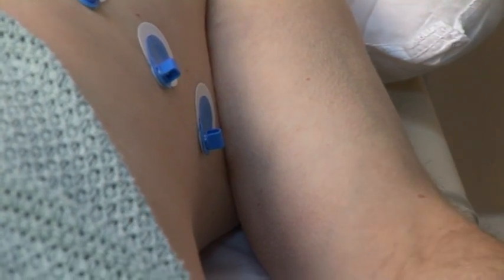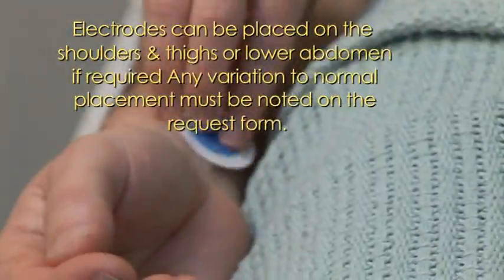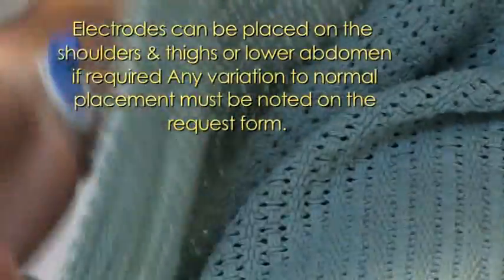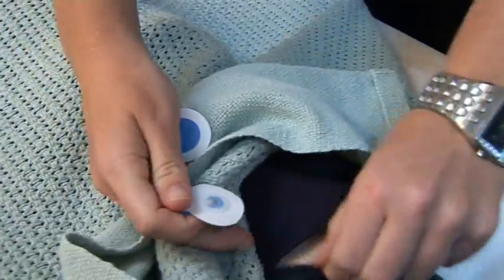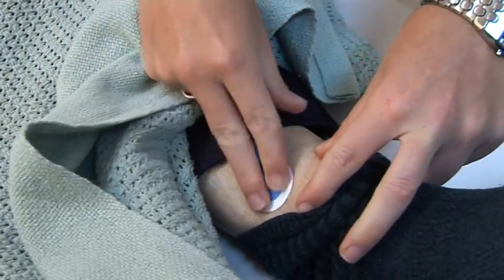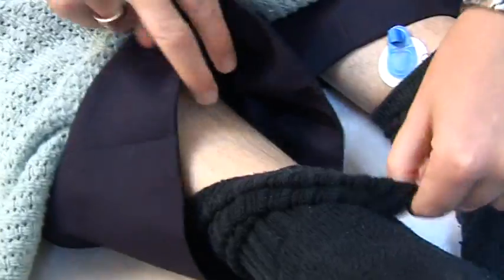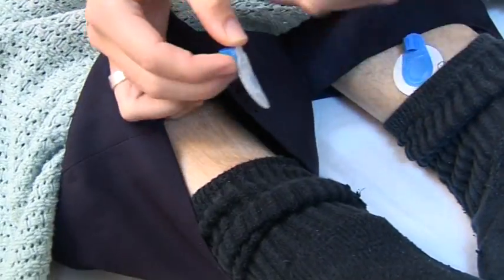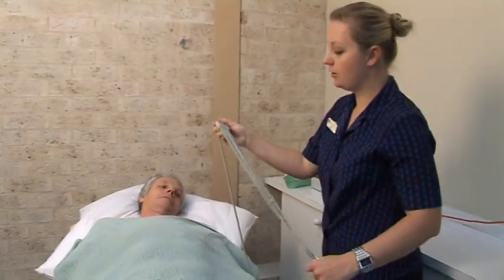I'm just going to place 2 on your wrists now. Okay. Excellent. Place your leads on the electrodes now.